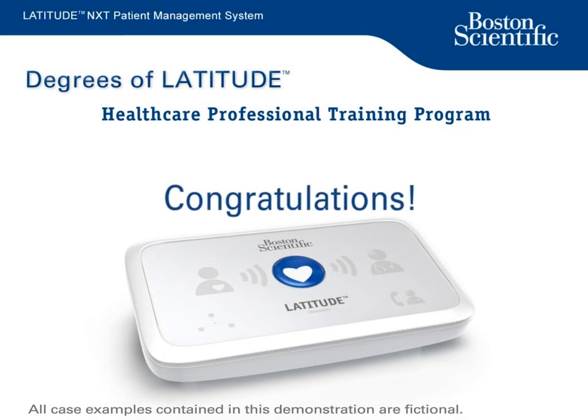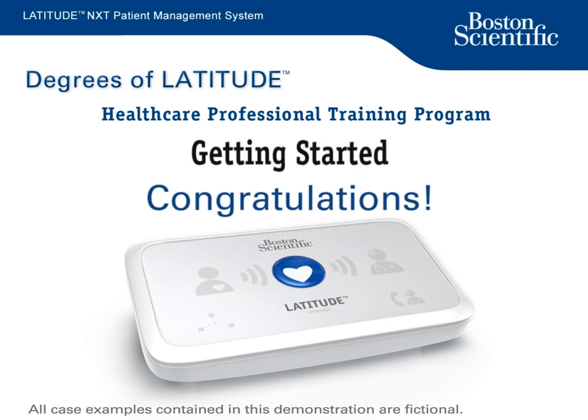Congratulations! You successfully completed the Degrees of Latitude module on getting started with Latitude NXT.